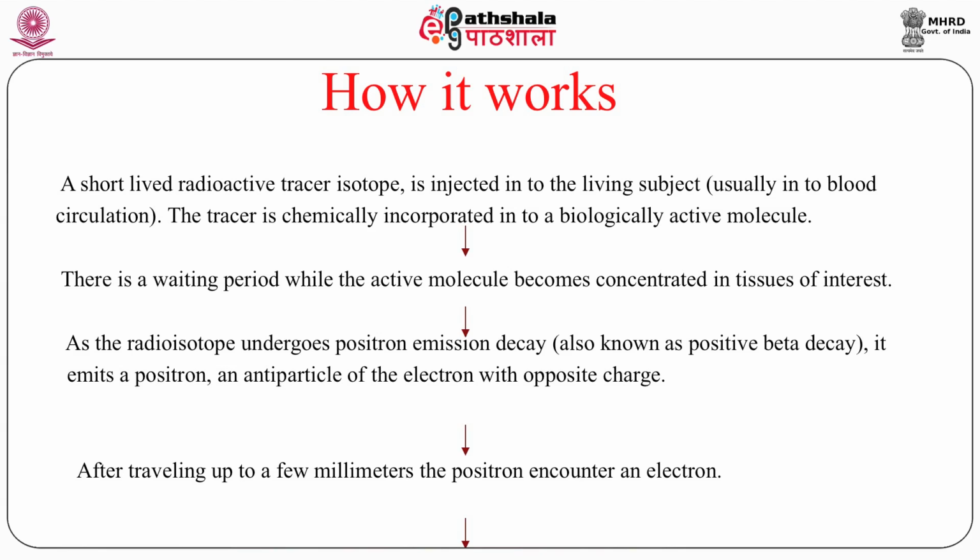What exactly happens is, the patient scanning does not start then and there itself. Before the scanning, the patient has to be kept waiting for 45 minutes. Why 45 minutes? So that activity is uniformly distributed and you get a good quality image. And the patient has to be kept at rest, because during movement of the patient, it may so happen that the activity gets concentrated in the muscles. So, the information which you are looking for, you may not get.